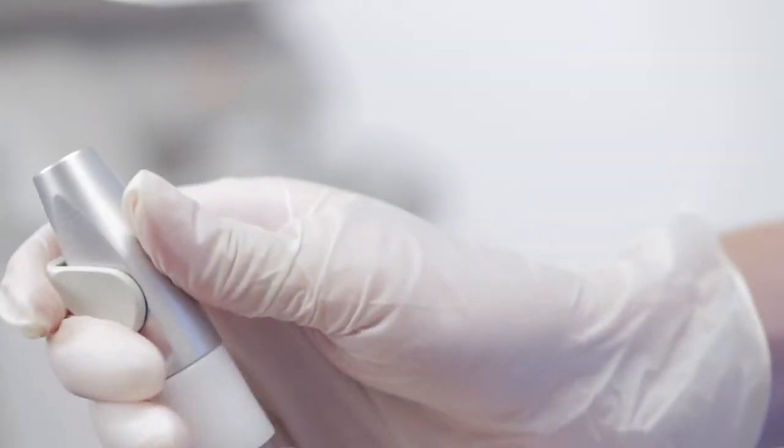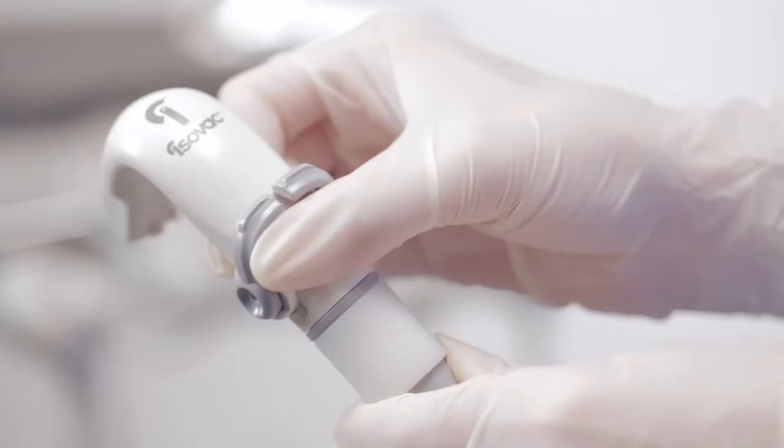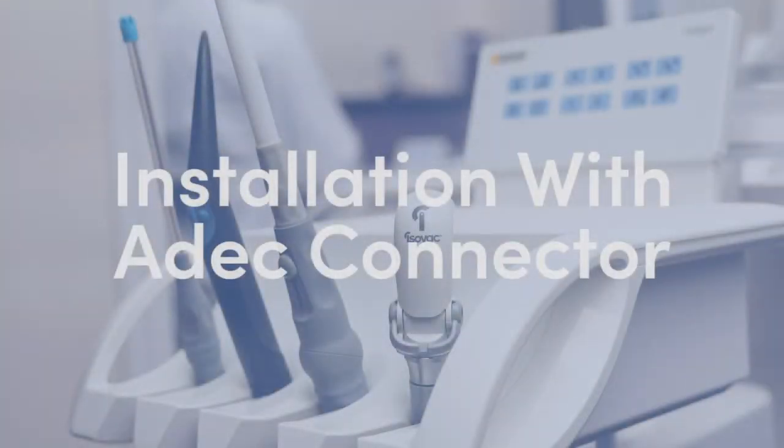To install, remove your existing valve from the HVE coupler. Attach Isovac directly onto the HVE coupler. Press firmly in place.